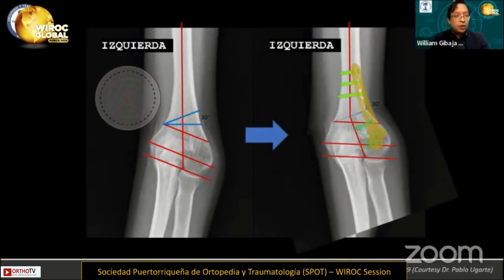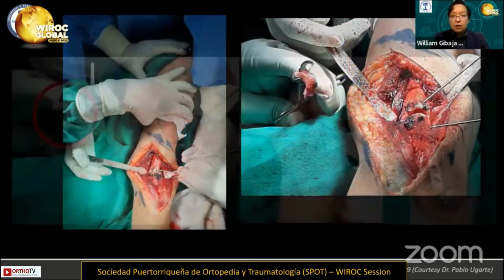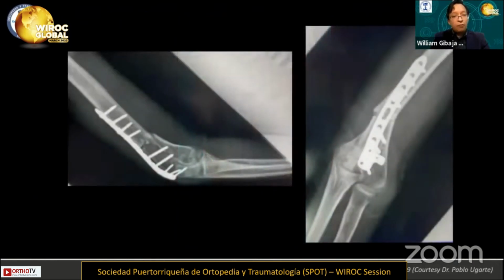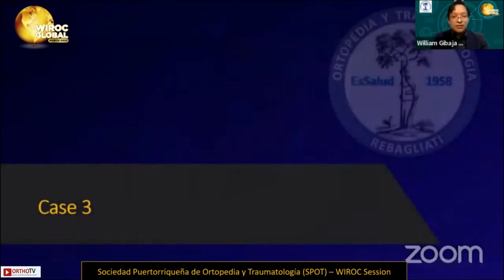We discussed this with the head treating physician, or the attending, and we also obtained these pictures from the OR, reaching what we have planned. We know that sometimes an osteotomy trying to be perfect is not always the goal, but to be functional. The patient at the one-year follow-up achieved these expectations.